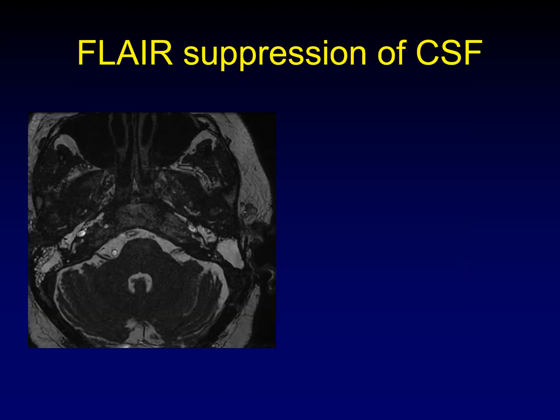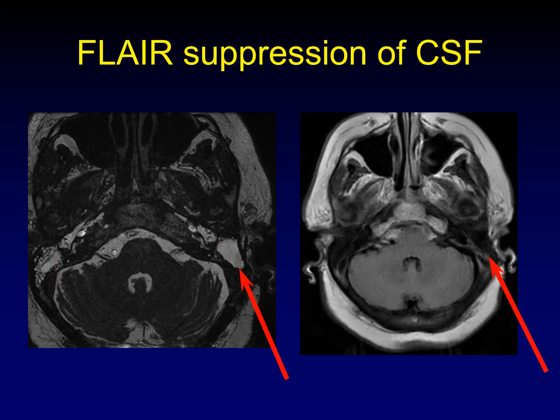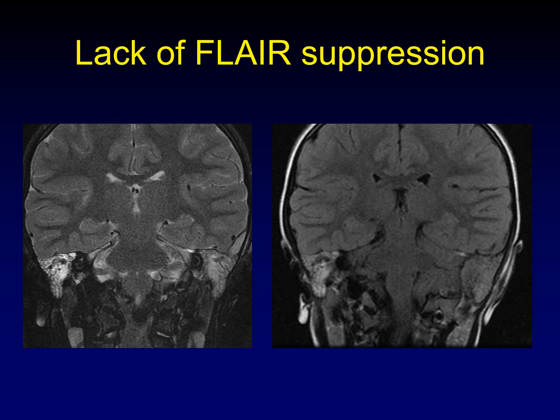When evaluating a dehiscent tegman, look for bright T2 signal inside the tympanic cavity. But how do you distinguish CSF from inflammatory fluid? FLAIR is your friend: if the T2-bright material suppresses on FLAIR, it's CSF. Even a tiny bit of protein prevents FLAIR suppression, so inflammatory debris remains bright on FLAIR, while CSF disappears. Here's the counterexample — inflammatory debris in the mastoid air cells bilaterally stays bright on FLAIR because it's proteinaceous, not CSF.